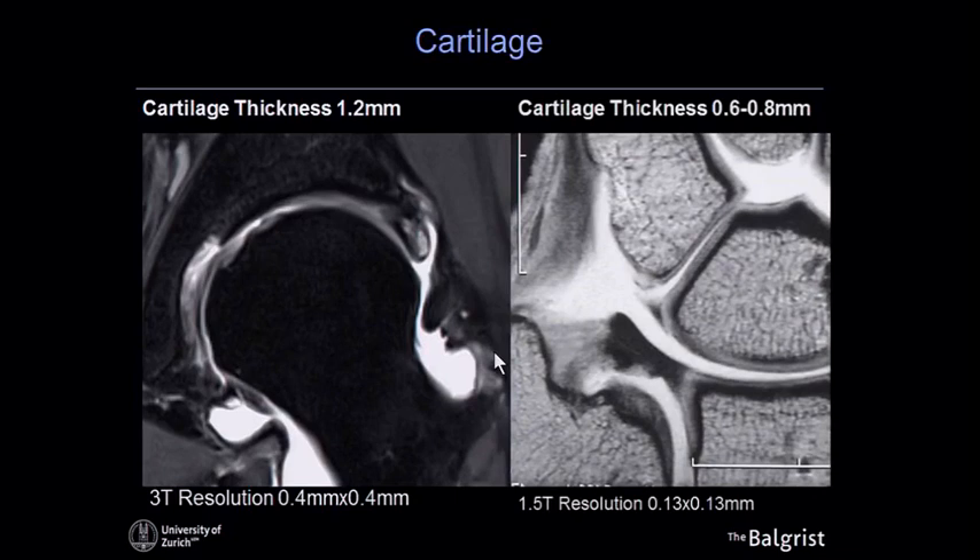For comparison, here is a wrist image where you can nicely see all the cartilage layers on the proximal carpal row. The resolution achieved in that wrist is 0.13 by 0.13 millimeters — that's high resolution. We achieve about six pixels per cartilage layer. Interestingly, this is quite an old image acquired in the year 2000 on a 1.5 tesla scanner. Why can't we do that on a hip joint?